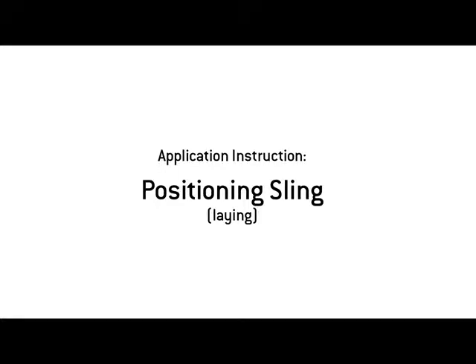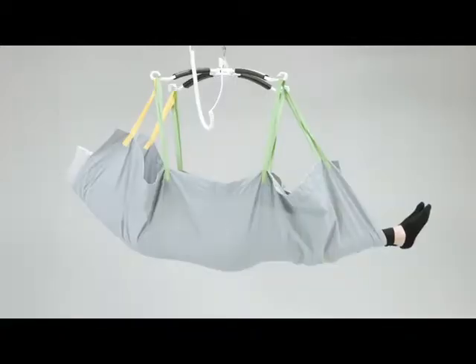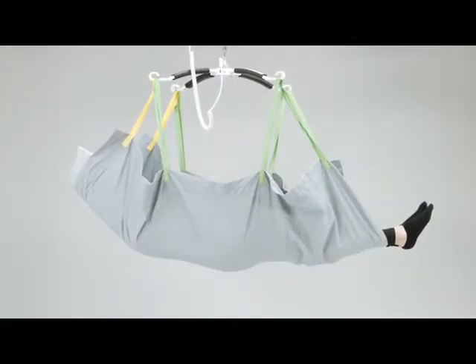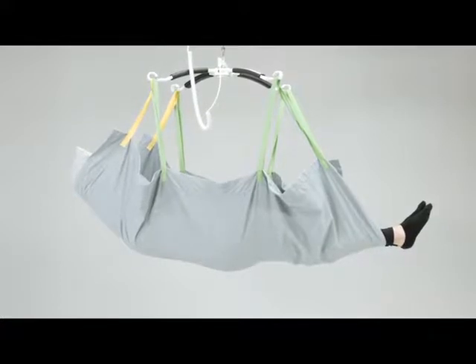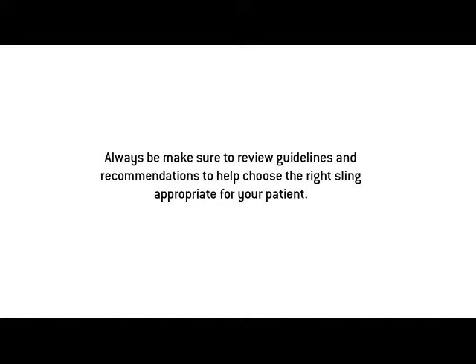We will now show how to apply the positioning sling from a lying position. The Human Care Positioning Sling is a sling for turning, repositioning, and lateral transfers. This sling comes in single patient use and reusable materials that can be left under the patient. Always make sure to review guidelines and recommendations to help choose the right sling appropriate for your patient.